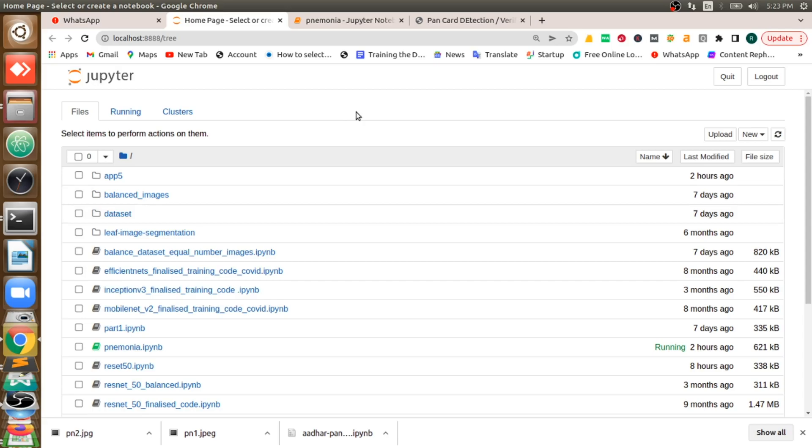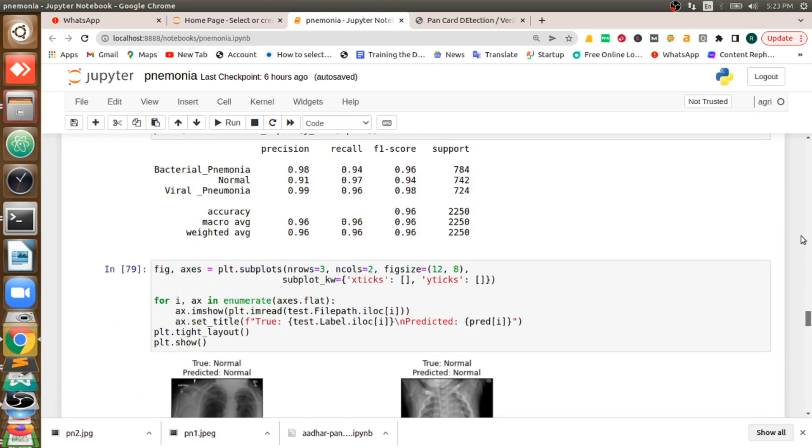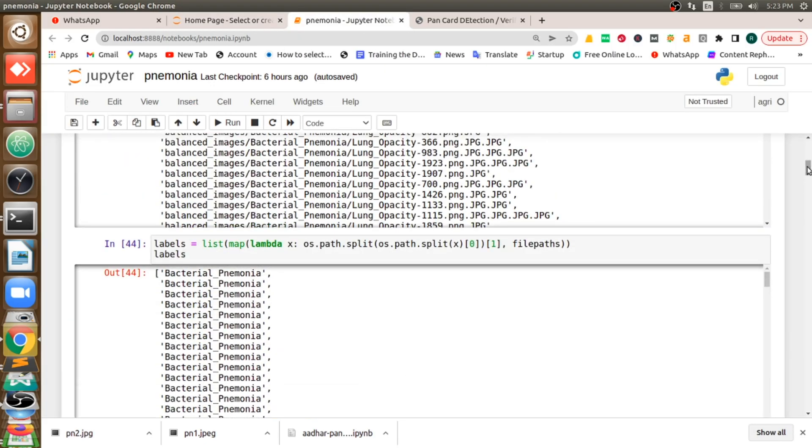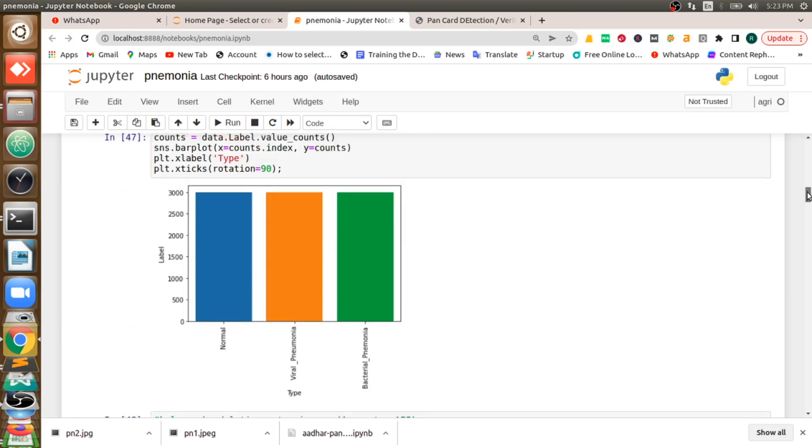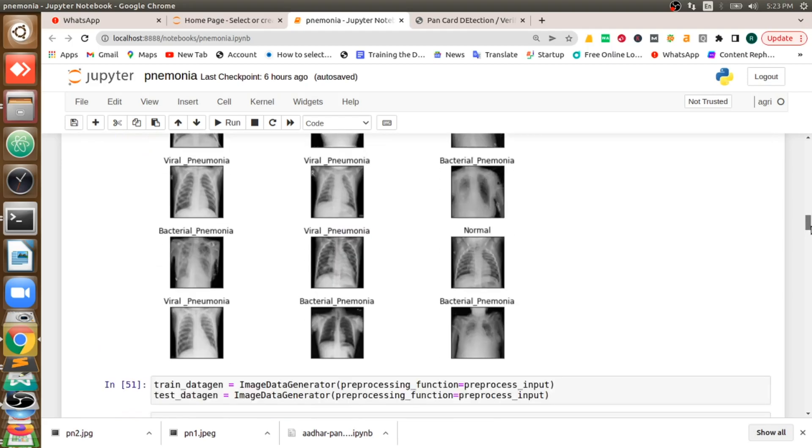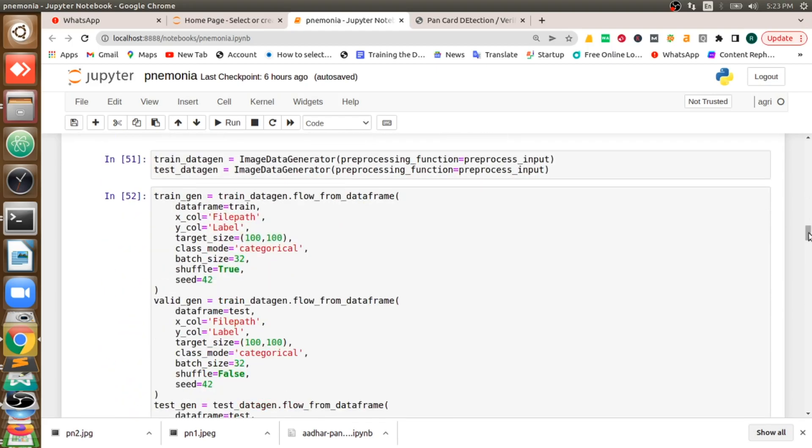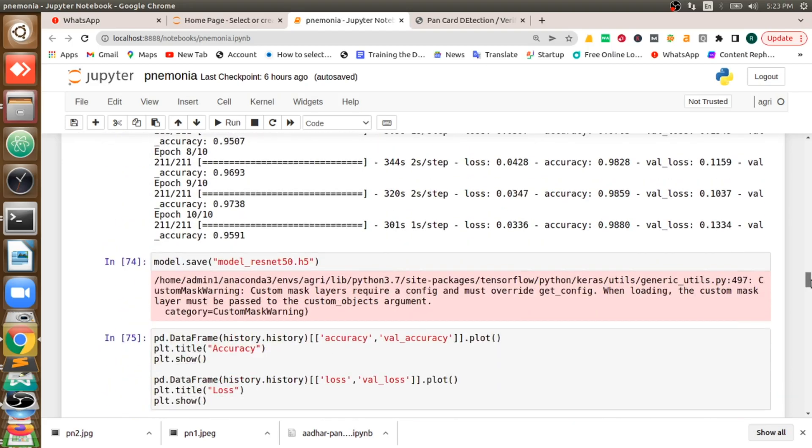Hi everyone, this is Raju from Smart AI Technologies. Welcome back to this video. In this video we'll see an application which can classify the type of pneumonia. Initially we'll take the dataset of pneumonia, we'll preprocess the pneumonia dataset and we'll balance them.